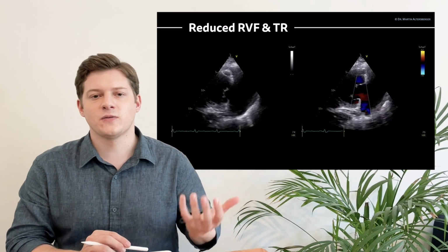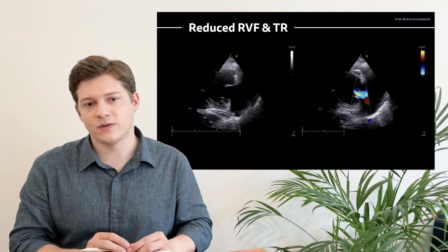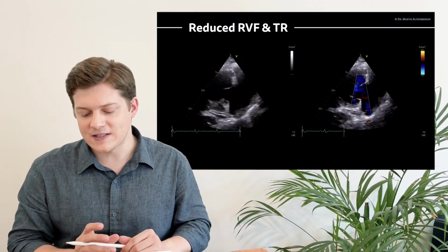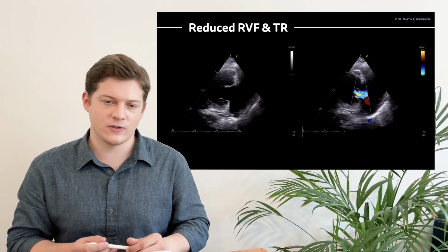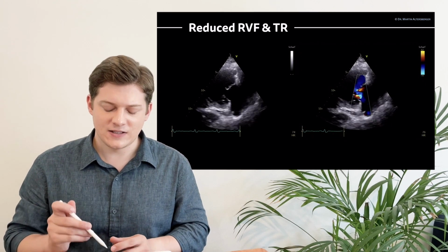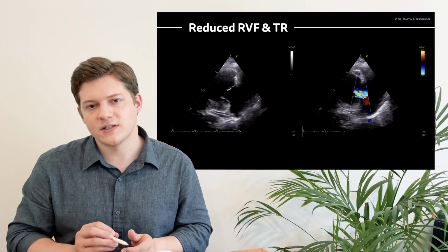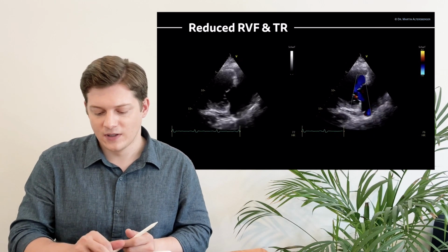because it gives a lot of information about the right ventricle, about the inflow of the right ventricle, about right ventricular function, about tricuspid regurgitation, and especially in some cases, if you cannot visualize tricuspid regurgitation in an apical window, you can always go back to the parasternal window and try it in this view. Why is it so nice? Sometimes the CW Doppler just has the perfect angle to measure systolic pulmonary arterial pressure in this view.